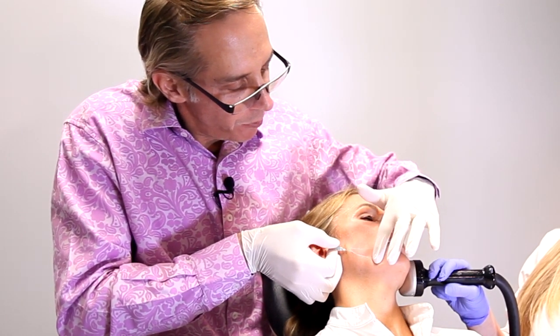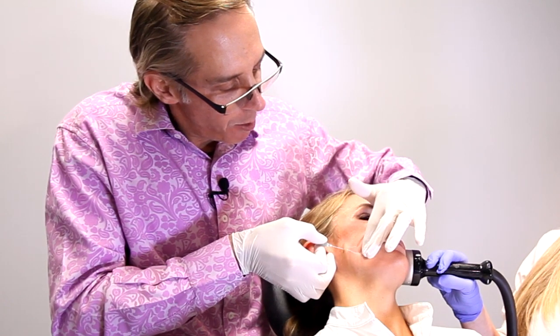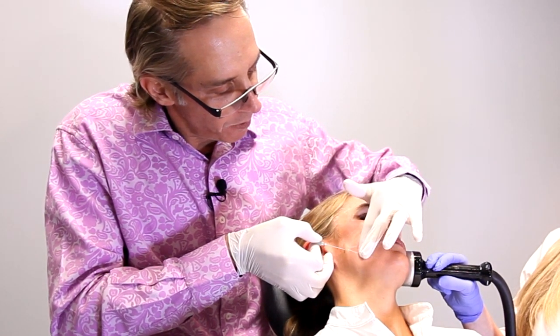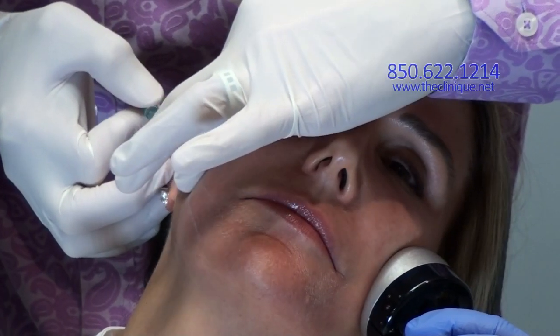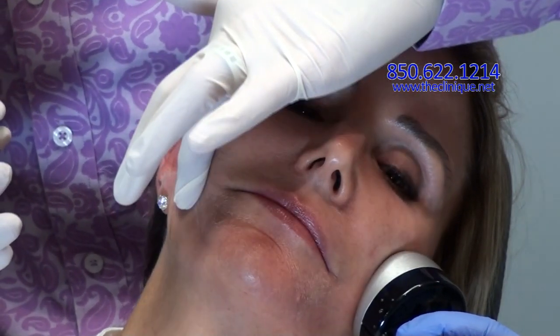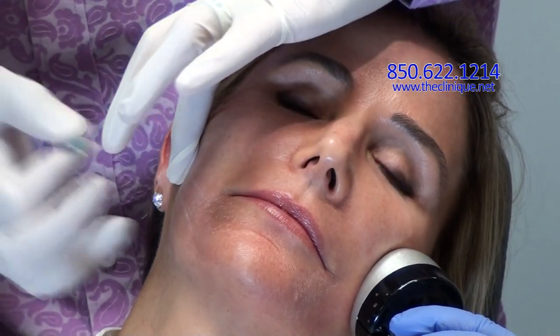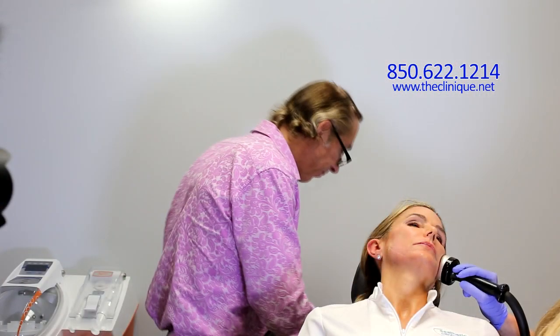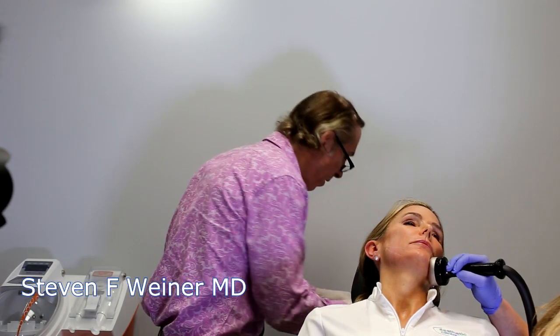And then I gradually withdraw this, and I'm engaging the barbs as I'm withdrawing. And there you have it. So this thread is in, and it's engaged, and it's pulling the side of the corner of her mouth and the marionette. We'll do one more. I didn't feel that at all. Awesome.